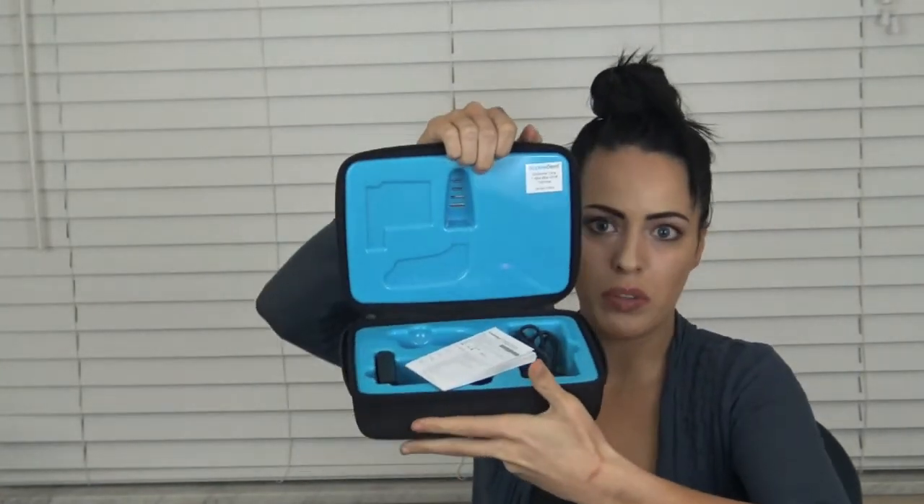So when I got it, I should probably get the box. Okay, so when I got it, it came in this. It's just a white box. It says Acceledent Aura. And inside the box is this, which is your little carrying case, which is pretty nice. So you just unzip it, and it's blue. It has little compartments inside to put your Acceledent.